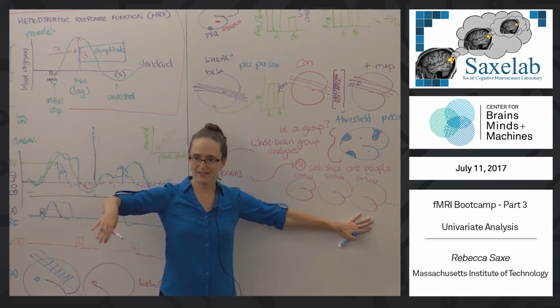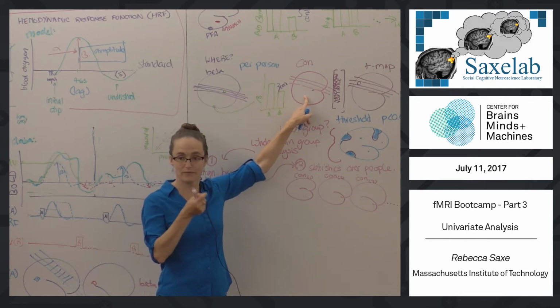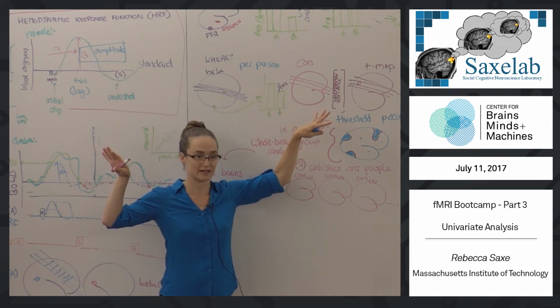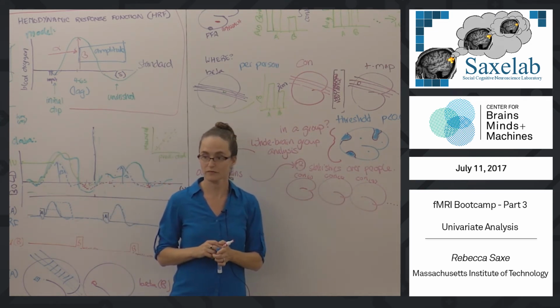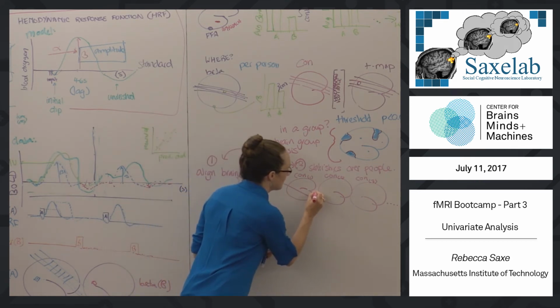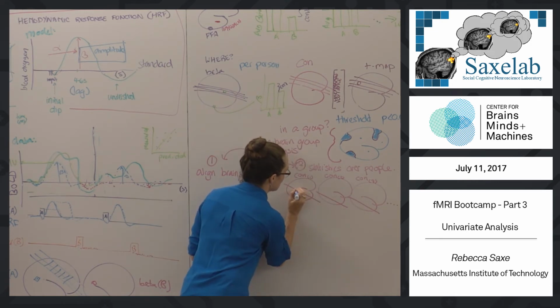We subtracted the beta of the nouns from the beta of the verbs. And we got a contrast image so that at each voxel position in each person's brain, we have the size of the difference between the betas for verbs minus nouns. Yes? Everybody's clear on that because that's what we did before? OK, so we did that for each person, and now we have that image for each individual person, right? OK, so that means that if we take a particular voxel, let's take this one.